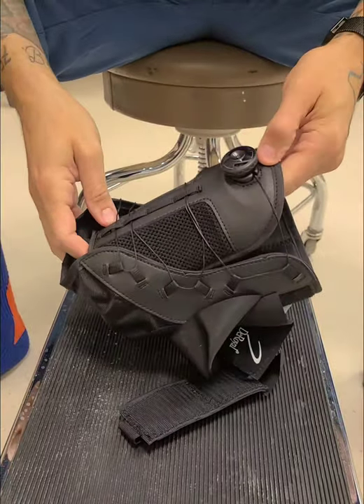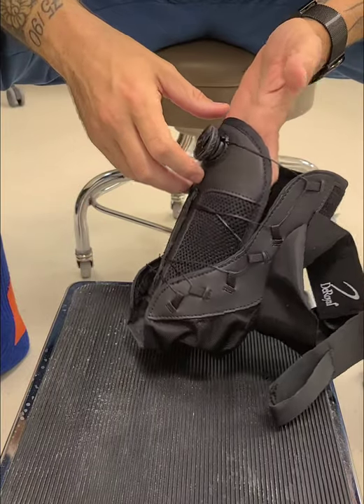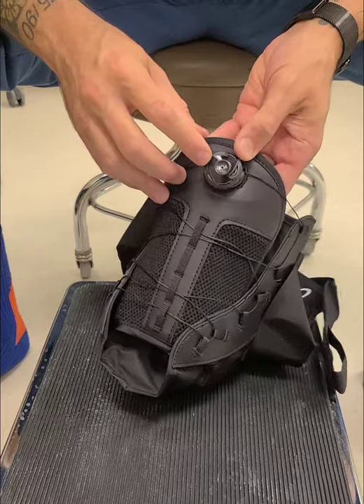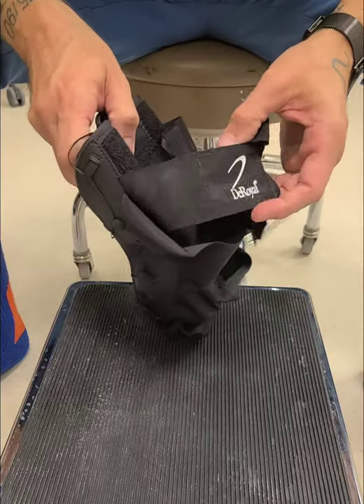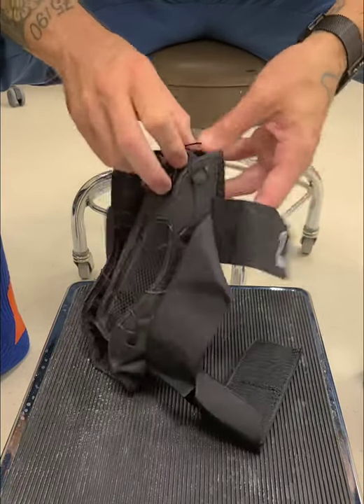Today we're going to show you how to use a BOA ankle brace. It's like a traditional lace-up ankle brace but uses BOA technology rather than using laces. I think the only brace company that makes this is DeRoyal — they got the patent or the license to use the BOA.